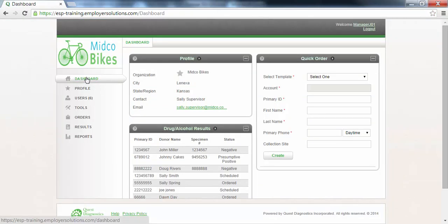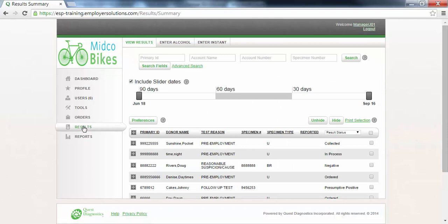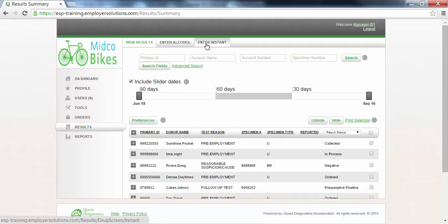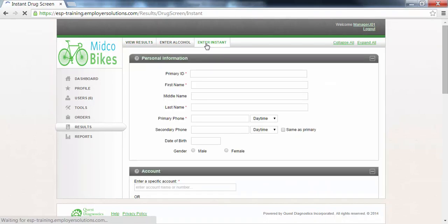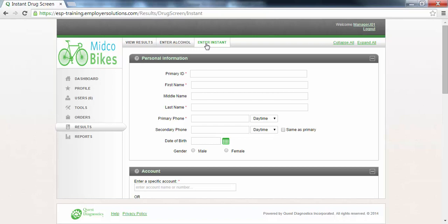To enter an instant test result click on the results menu in the list of menu options available at the left. If your user account has permissions enabled you will see a number of tabs at the top of the page. Click the enter instant tab to begin the process of entering an instant test result. If you do not see the enter instant tab and need access to this function please contact your organization system administrator to be provided access.